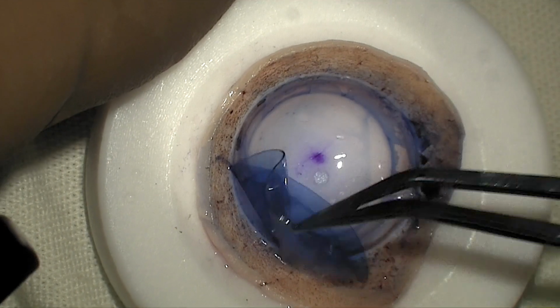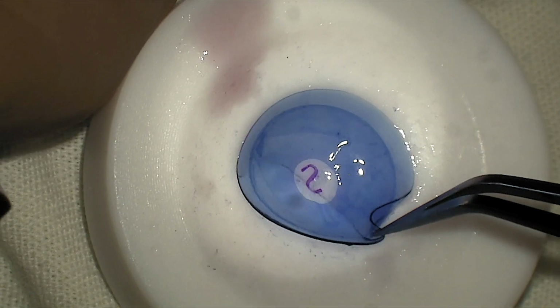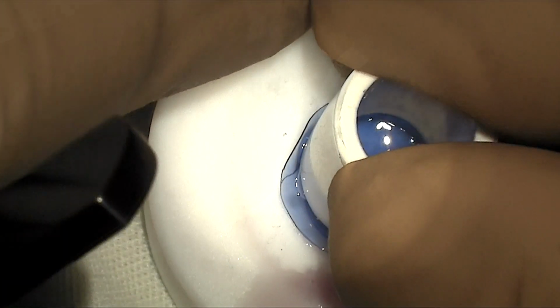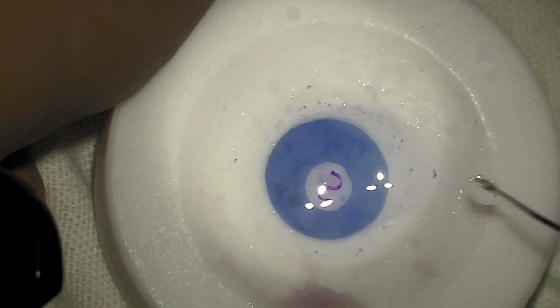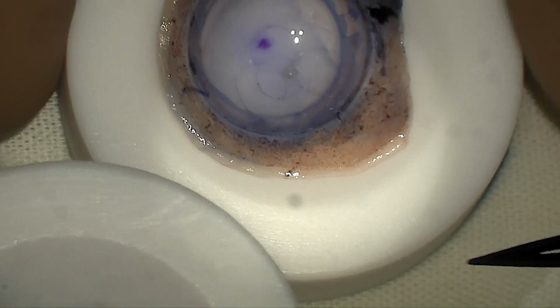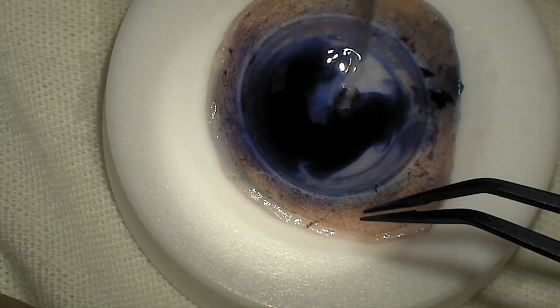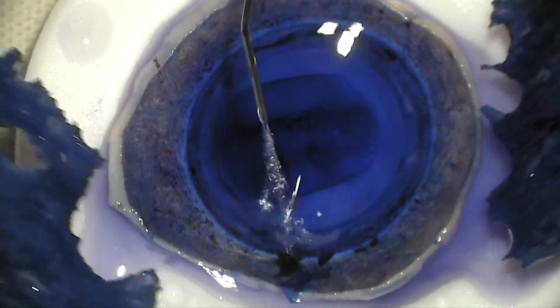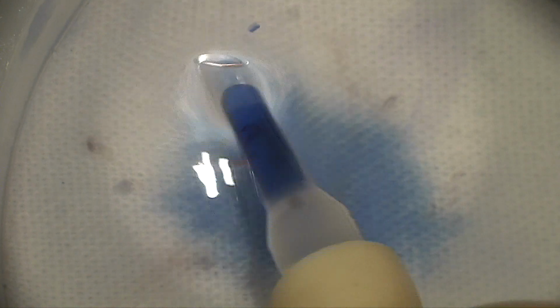The BCL and DM complex is flipped back. It is then placed on the second Teflon block with the endothelium side up. And now the final 8 mm trephination is done. The DMEK graft is carefully transferred to the cup of the donor tissue and stained with trypan blue and subsequently washed with BSS. The stamped graft is now ready. It is then transferred to a petri dish containing BSS, ready to be loaded into the injector system.